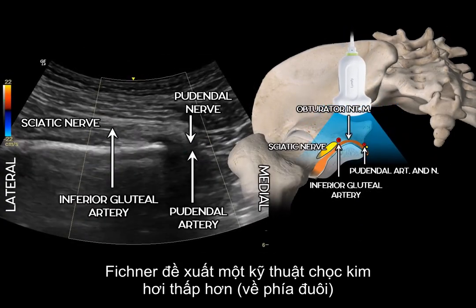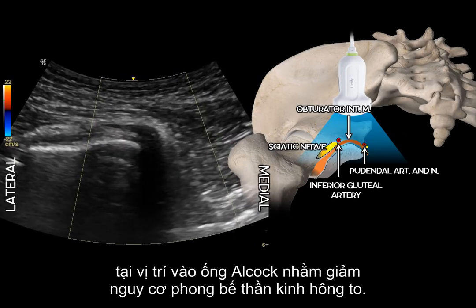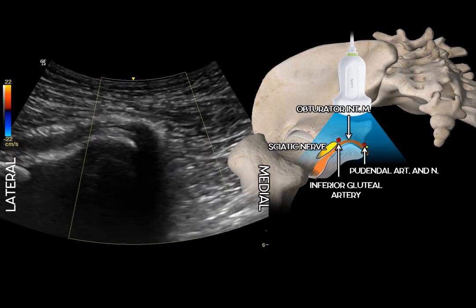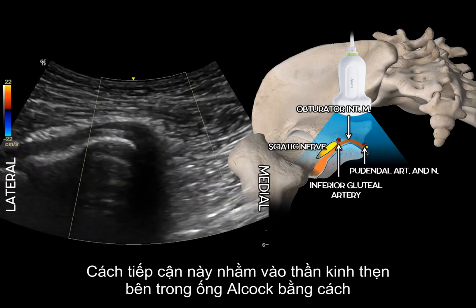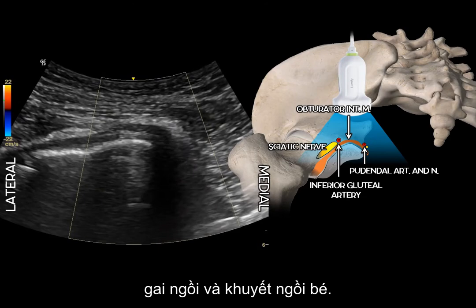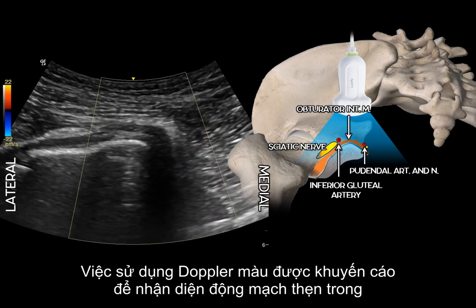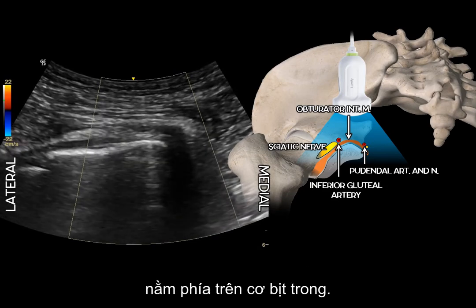Fitchner suggests a slightly more caudal technique at the entry point to Alcock's canal in order to reduce the risk of a sciatic nerve block. This approach targets the pudendal nerve inside Alcock's canal by following the margin of the hip bone sonographically along the greater sciatic notch, the ischial spine, and the lesser sciatic notch. The use of color Doppler is advisable to identify the internal pudendal artery above the internal obturator muscle.